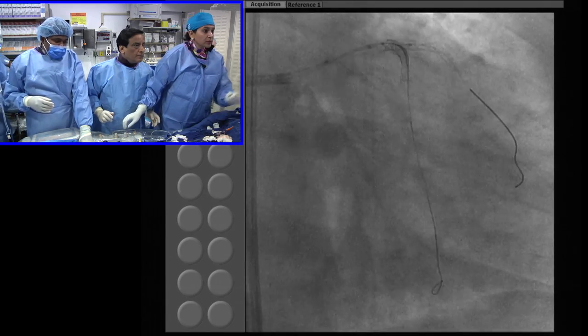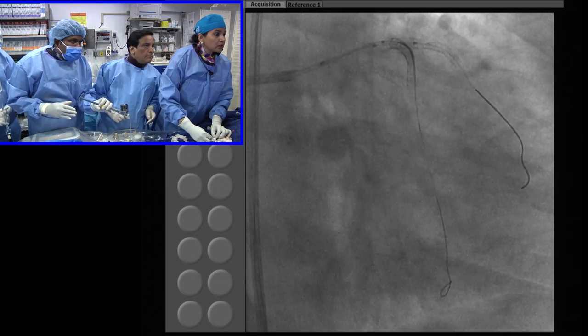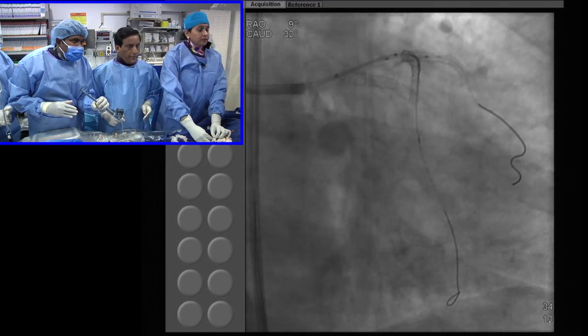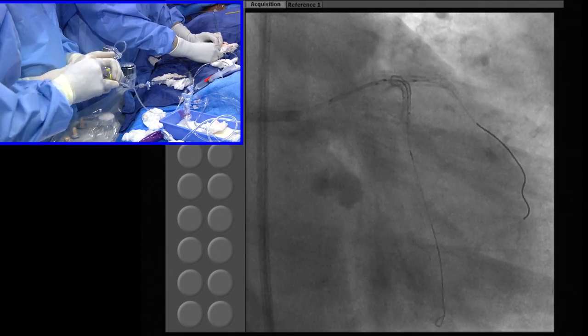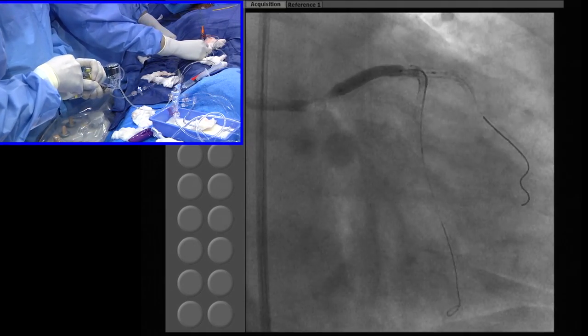So you need to bring the... Now where is the dot? There, you see that one? You see the dot there? Cine, so show it to everyone. Exactly. Okay, at the overlap. Go up. Go up. Yeah. Good. 16. 18. Down.